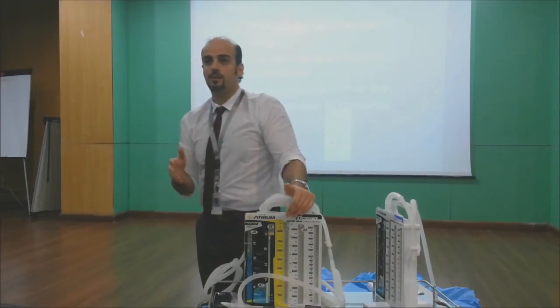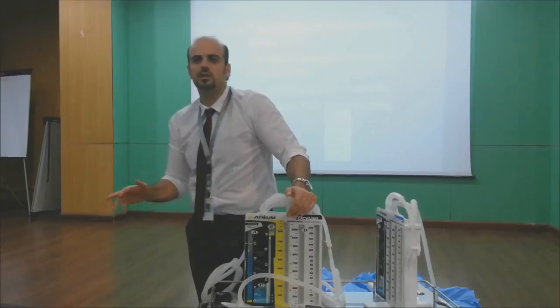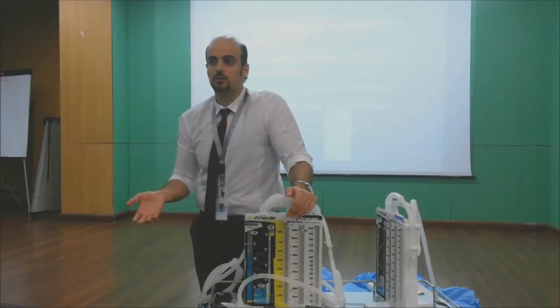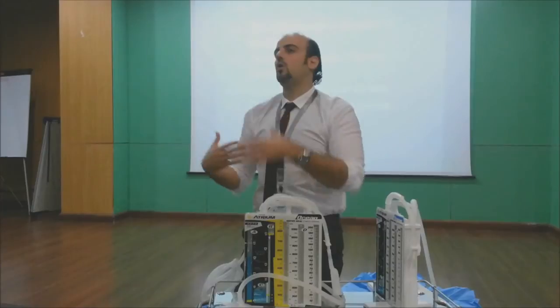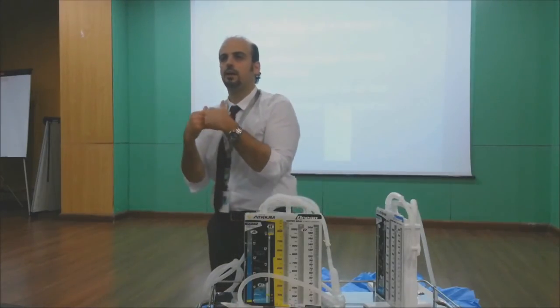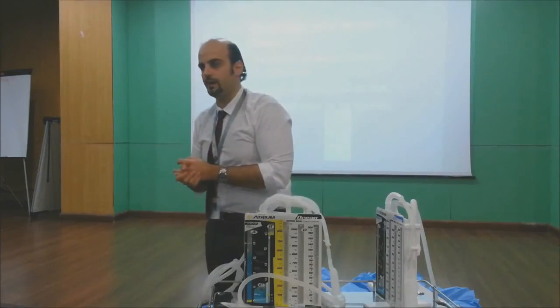After a while of the patient, you all notice this. After a while of insertion, after 2 weeks or 3 weeks, there is no oscillation movement. And there is drainage. Right? In 24 hours, you can find 200 or 300. But there is no oscillation. Why? There is fibrosis. All the mechanisms that we talk about, the diaphragm and chest wall expanded, the diaphragm going up, it's an isolated cavity. Fibrosis around the drain.